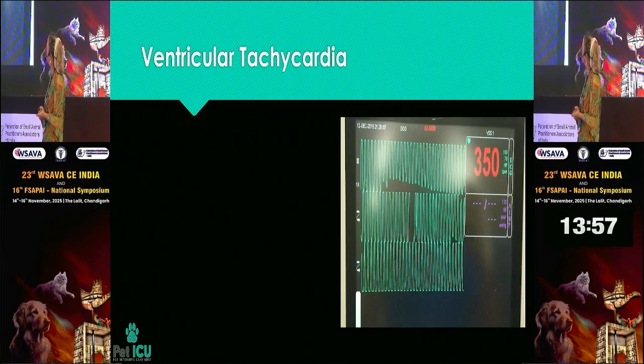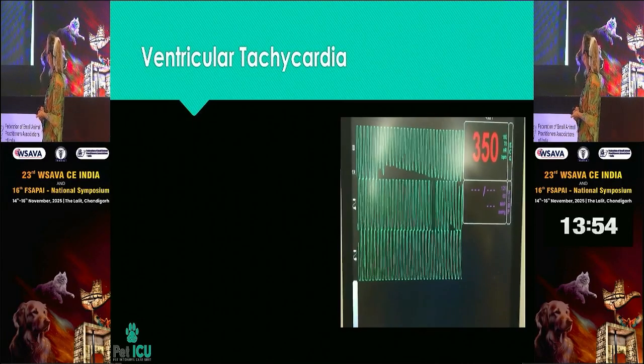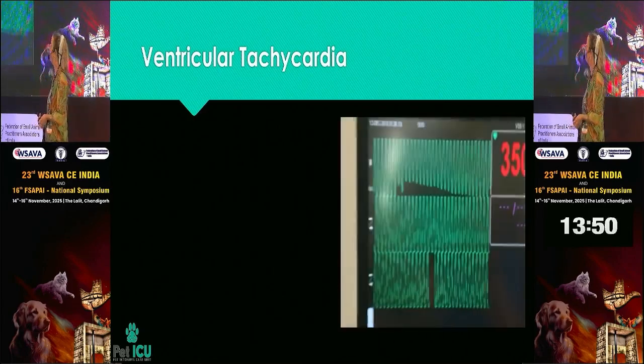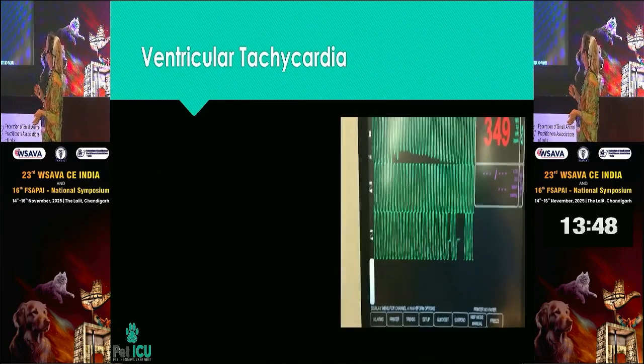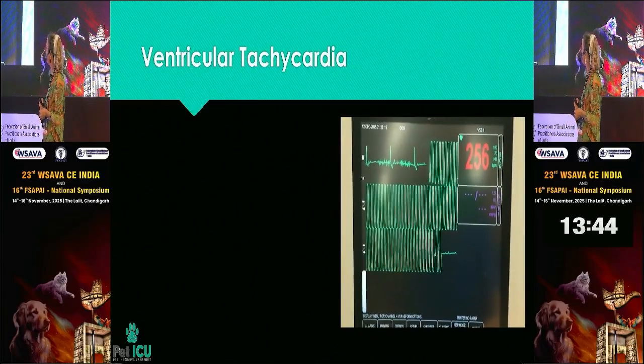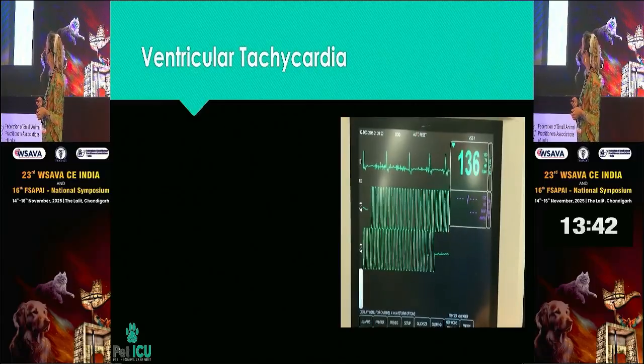This is the dog before that was in VTAC. You could see how fast this rate is. We couldn't feel pulses. This was an arrest rhythm, and we were giving lignocaine. Converted with lignocaine. And he converted.